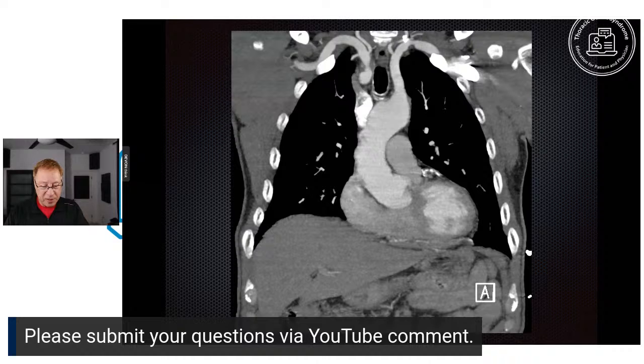You'll notice right in the center that curved, bright white thing, that's the aorta coming out of the heart. That's the big artery in the heart. And you'll see two subclavian arteries up around the first rib at the top of the picture. You'll see next to those subclavian arteries the very bright white first rib. So you can see on this how well the vascular structures can be seen with contrast and how all the bones can be seen. And for many docs, that's enough. That's what they need to see.